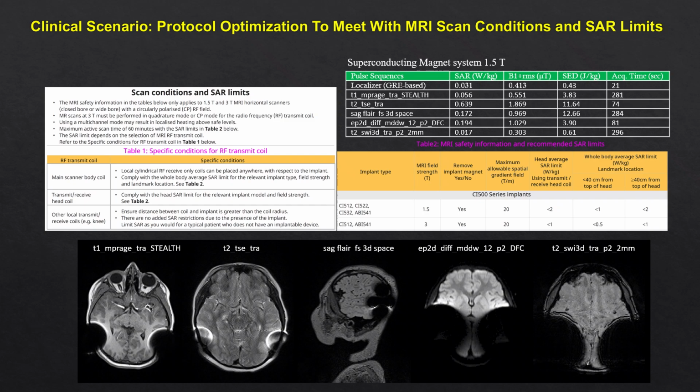This case demonstrates that, through systematic protocol-level optimization, it is possible to achieve a safe balance between image quality and RF energy deposition. The examination was completed successfully, fully compliant with MRI safety requirements, and without exceeding device-specific SAR limits.